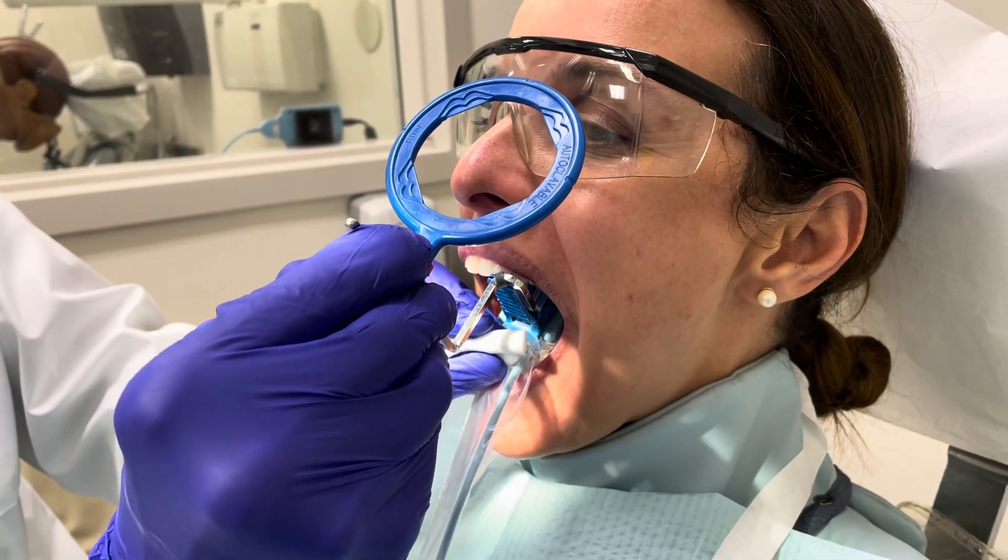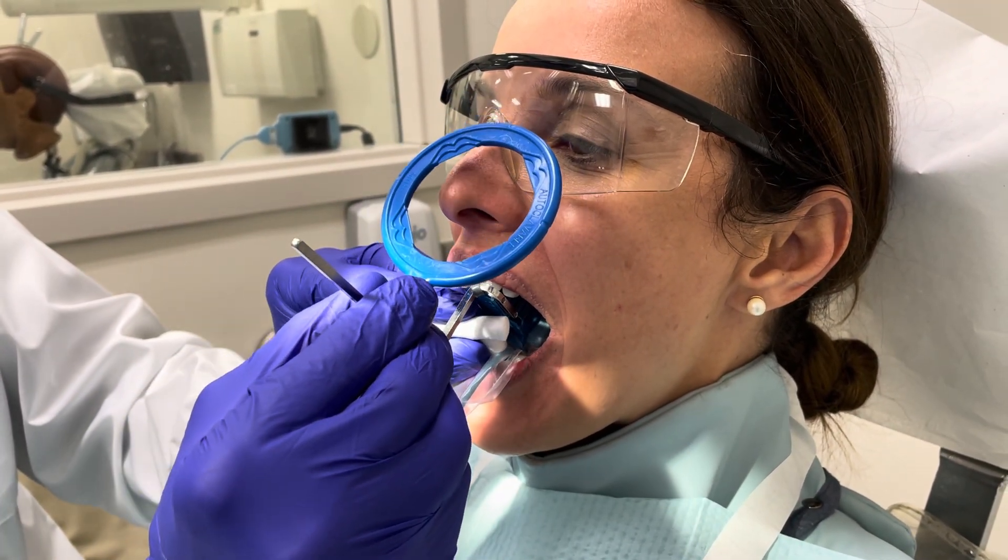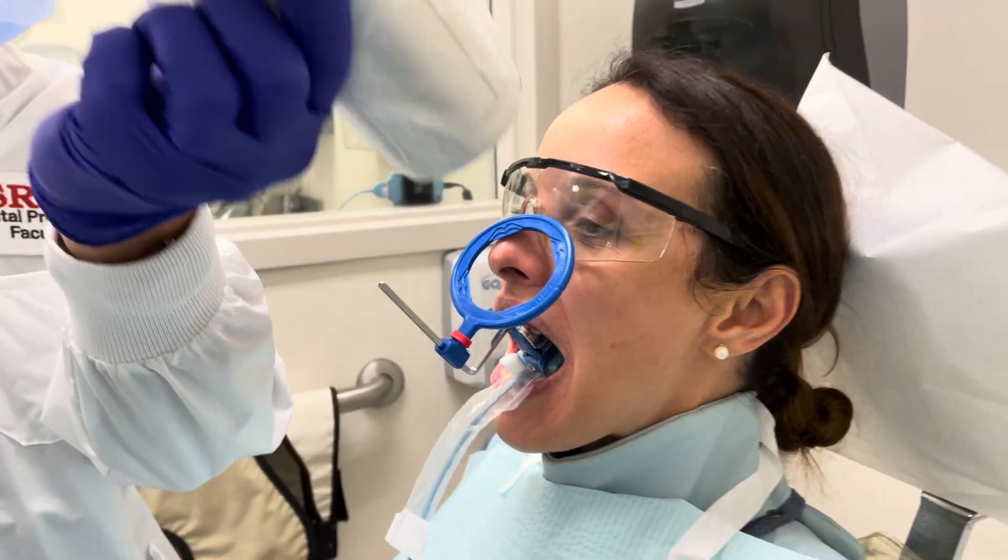Gently bite down. There we go. And then bring it up against the nose there, lining up.